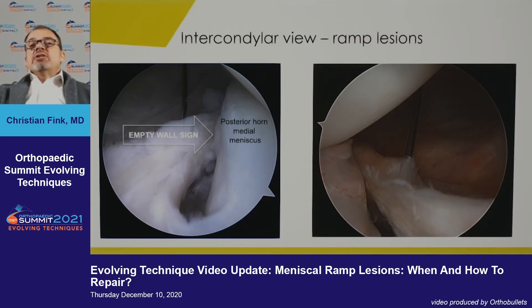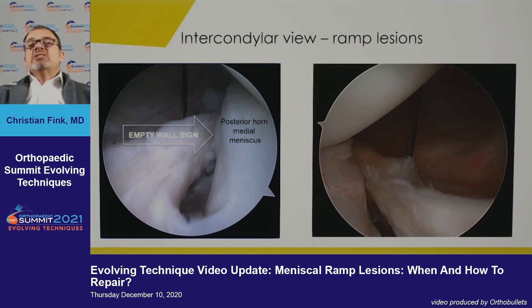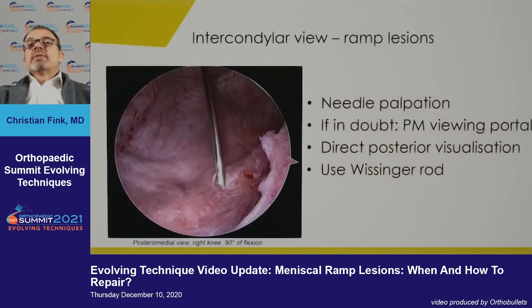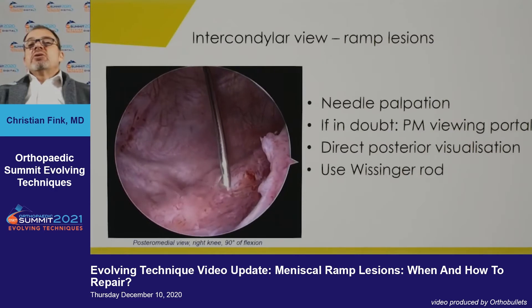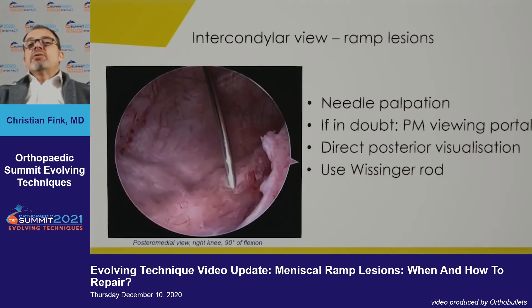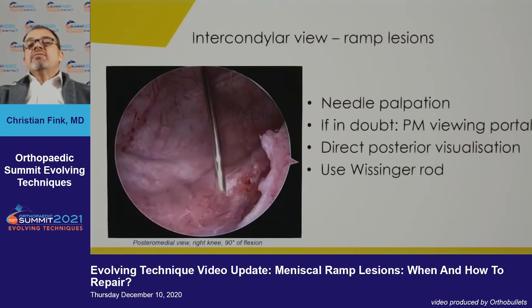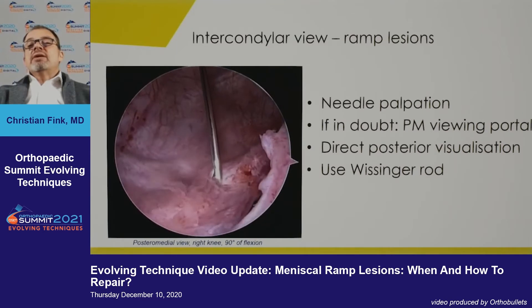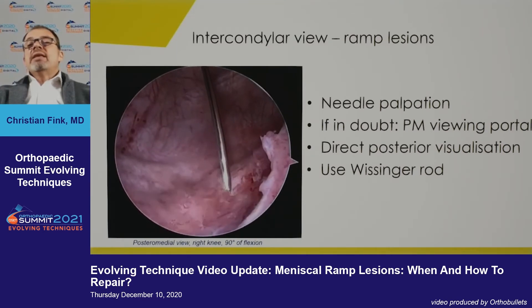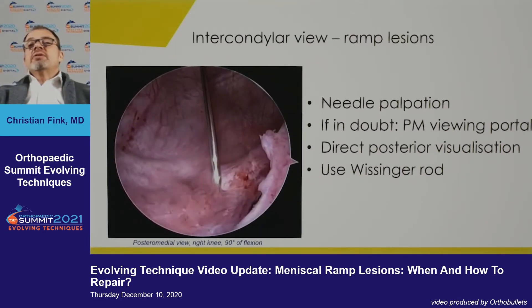It depends on whether this is an acute or chronic lesion. In an acute lesion you might have a very small hole, but in a chronic lesion you really see big distraction, and when you externally rotate the tibia, you end up with a huge defect in the back. You always need a posterior medial incision — first use a needle to palpate the tear, which is also very important.